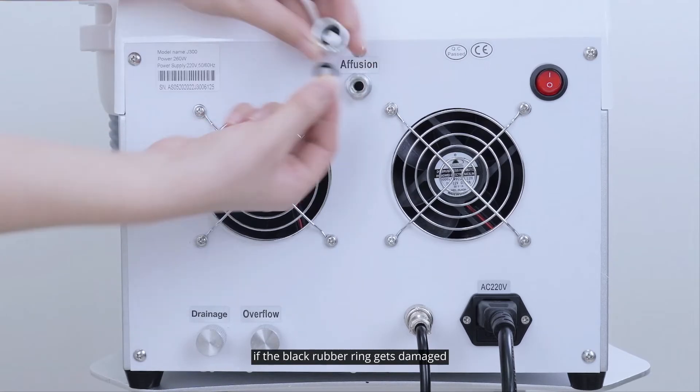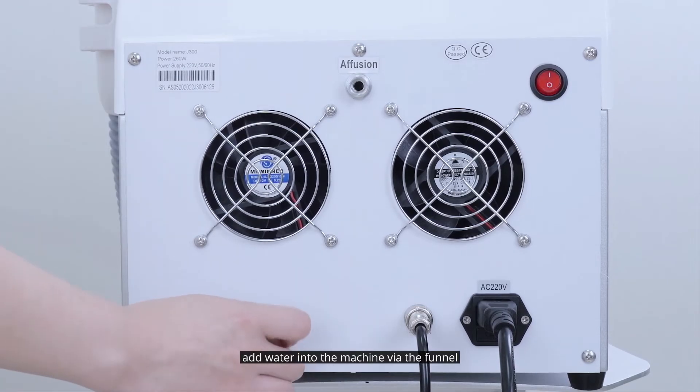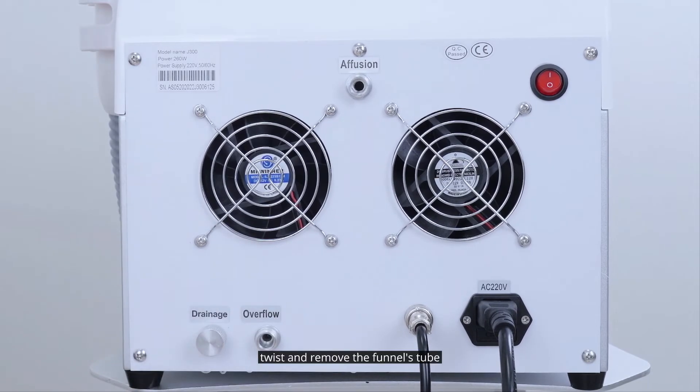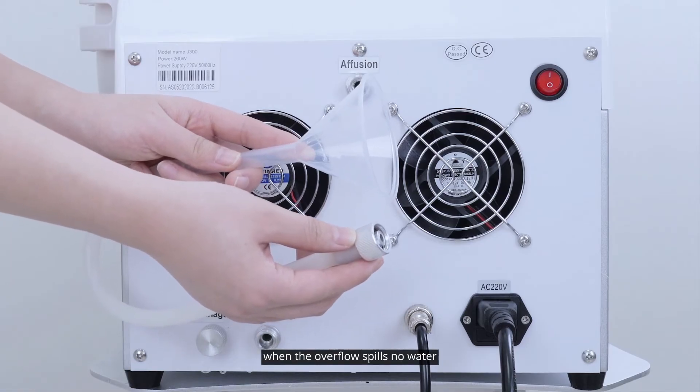If the black rubber ring gets damaged, please replace it with a backup one. Add water into the machine via the funnel — it's full when water spills over the overflow. Twist and remove the funnel's tube, then screw the two nuts tight.